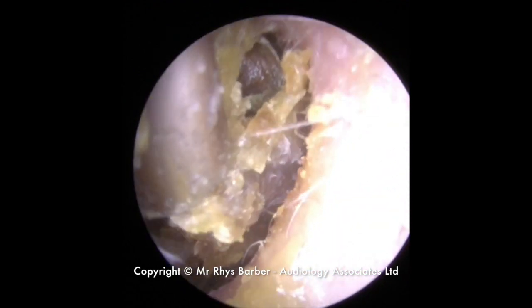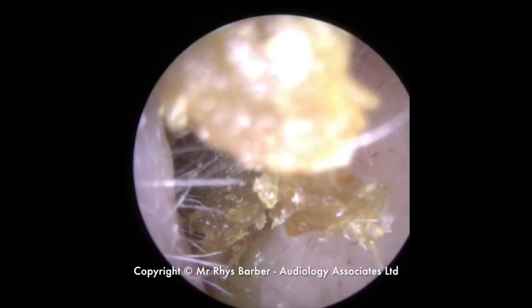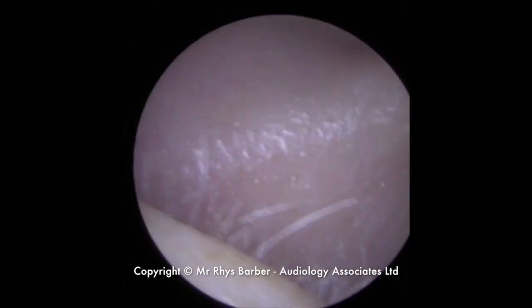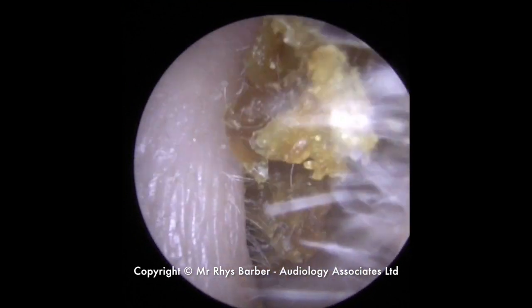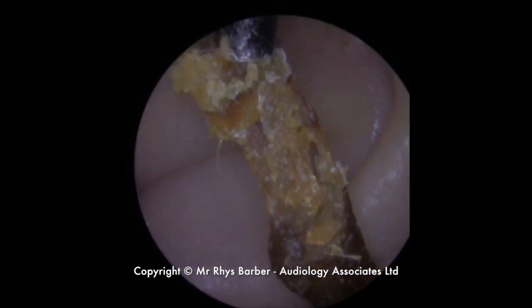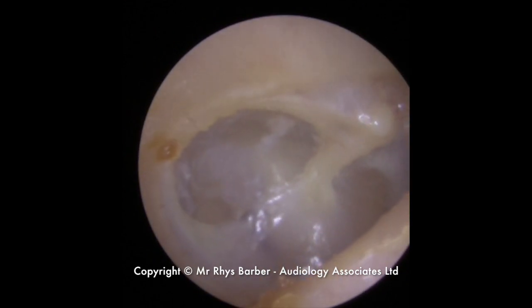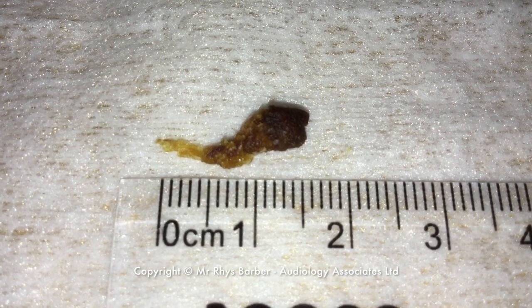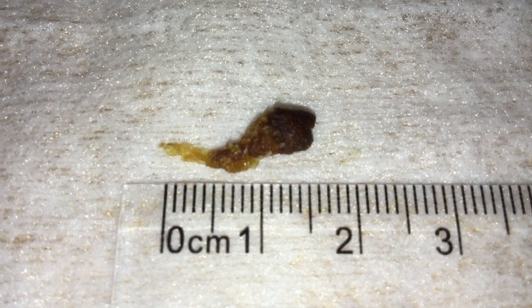I'm really struggling to get a good grip on this. Now we're starting to get a little bit of movement to that skin. You can see that's broken — it's so frustrating because it looks like it's all going to come out, but it doesn't quite all get out. Really wiggling and loosening that skin out. So you can see all the skin and wax at the base of that chunk there. When we look in there, the eardrum's got a little bit of retraction to it — that's where those two little dark circles were. Most of the wax got sucked into the machine. So this is that large piece that we took away — about one and a half centimeters with that dry skin. Quite an interesting one to watch.